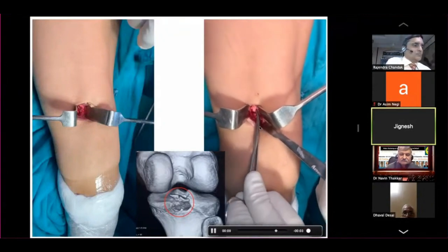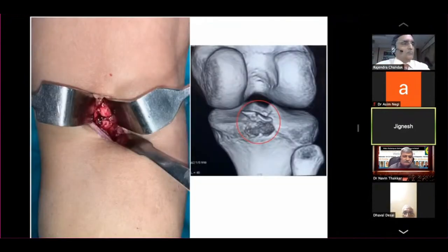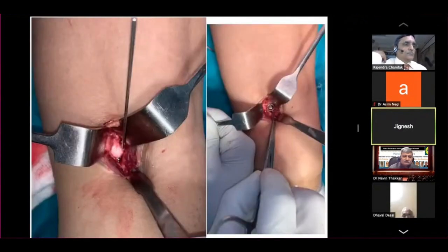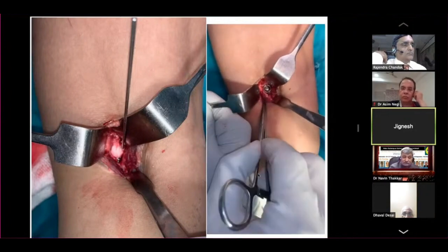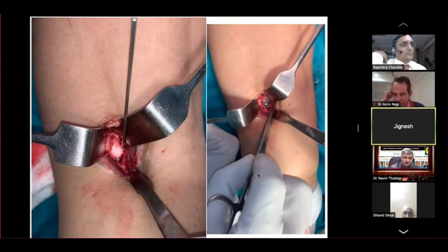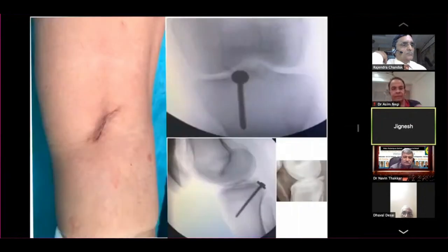I can elevate and reduce the fragment. Fragment is provisionally fixed with a K-wire eccentrically, leaving the center part of the fragment for screw placement. I drill the proximal part of the fragment and place a fully threaded, non-cannulated screw — about 50 millimeters with a washer. If the fragment is in 2 to 3 pieces, I use a spike washer. And that is the closure — one screw.